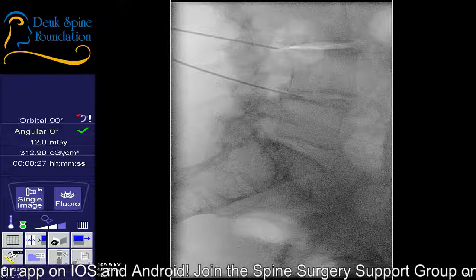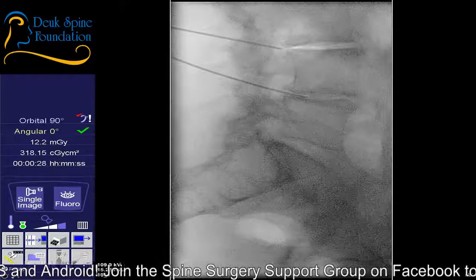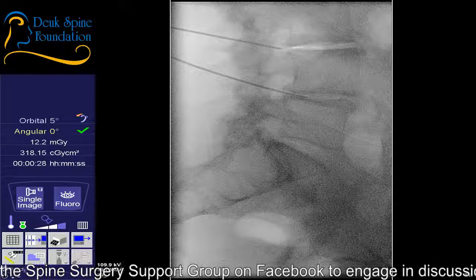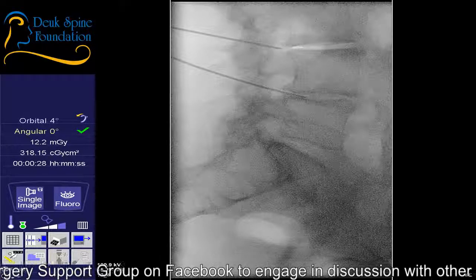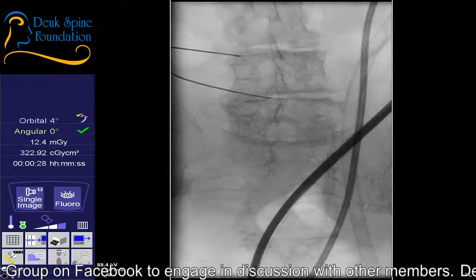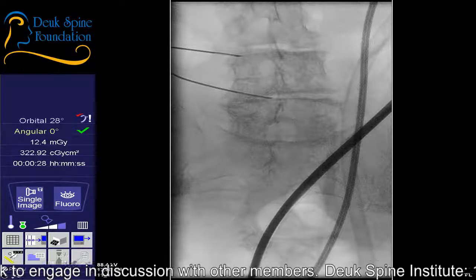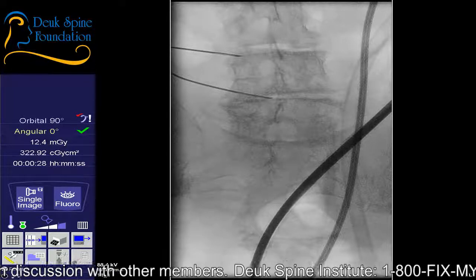We're right where that second herniation is. So this patient has degenerative disc disease, and on a scale of 1 to 10, it's probably an 8 structurally, an 8. That looks good. I've seen slightly worse. Maybe she's a 9. I've seen slightly worse, but she's really bad.